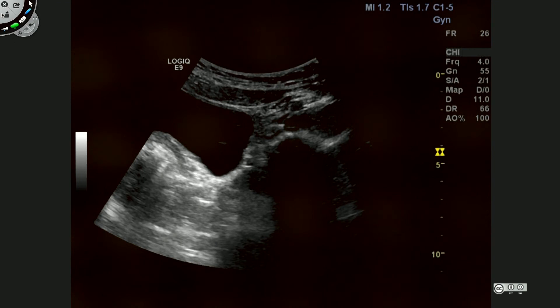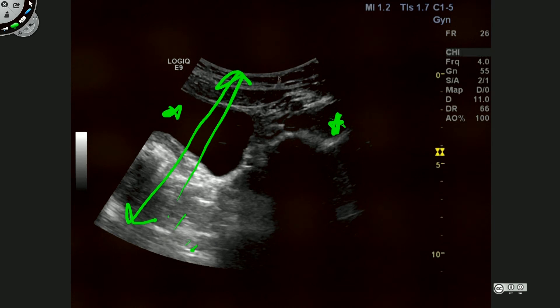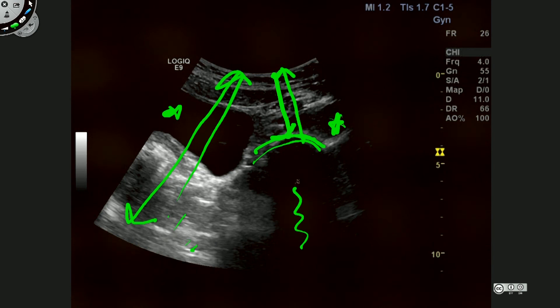Returning to the example of the urinary bladder — again this is a transverse image. We have our urinary bladder here full of fluid, and this is the left adnexa in this particular patient. As we can now appreciate, our ultrasound beam passes down through the bladder and back to the transducer, giving us posterior enhancement here because of the high signal. However, once we come over to the left adnexa, the sound waves come down and meet a very strong reflector from gas within the bowel, reflected straight back to the transducer. So we end up with a very high signal from the reflector and no signal beyond it — this area is known as posterior shadowing.